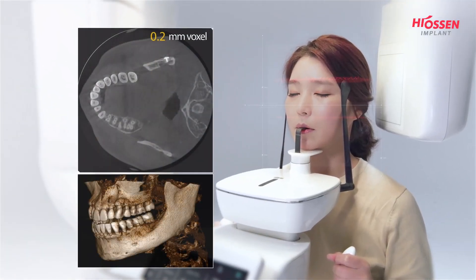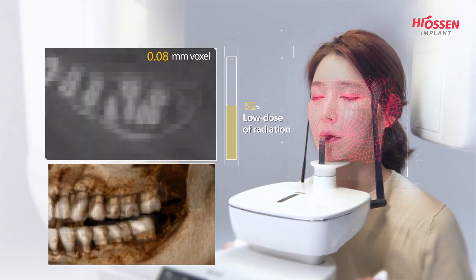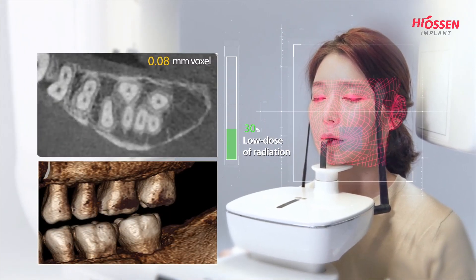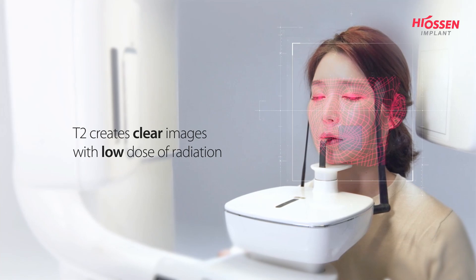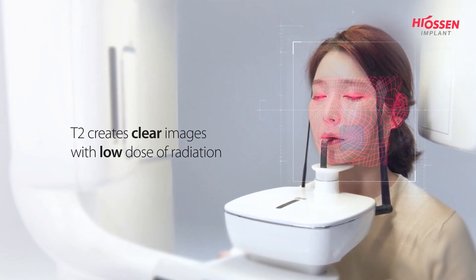All you need to do is take an image of the area you need to examine, and a low dose of radiation is used for generating better image quality.